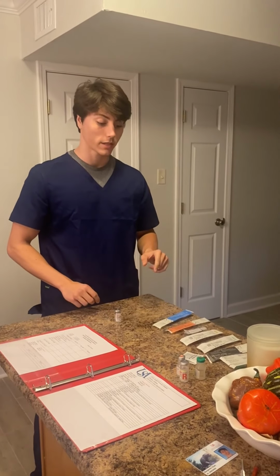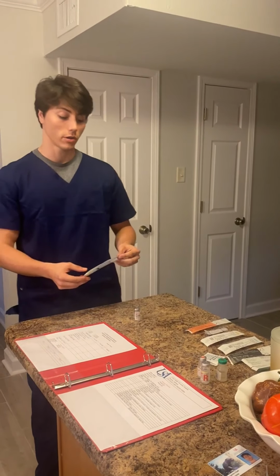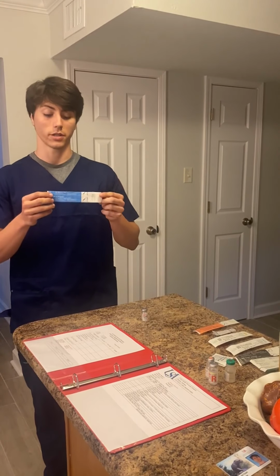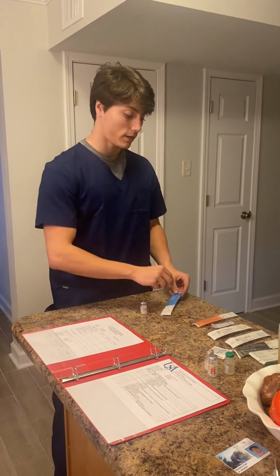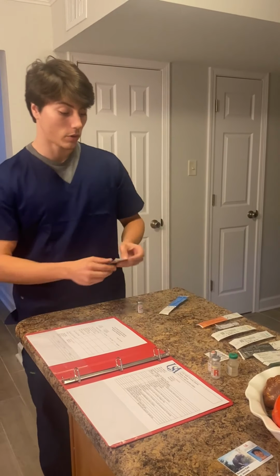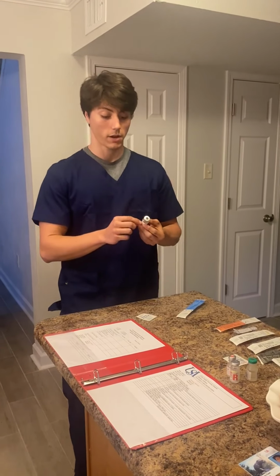Okay, so the next thing that I'm going to do is select the correct needle for the route that we're doing, which is subcutaneous, and that's going to be the 1 milliliter tuberculin syringe with a 25 gauge needle and 5/8 inch long.